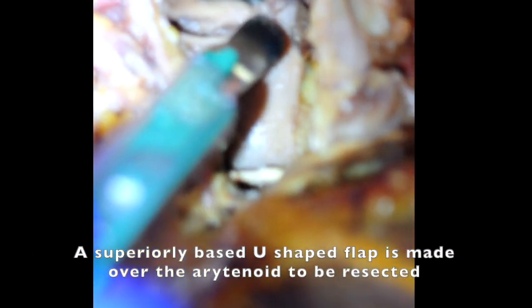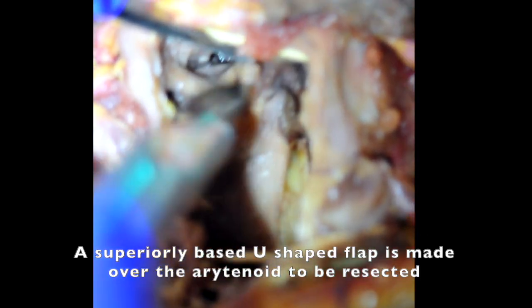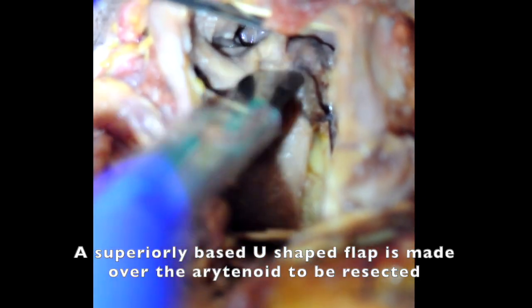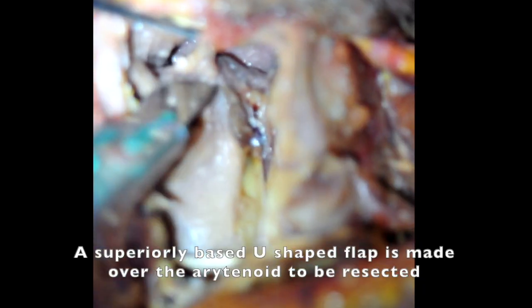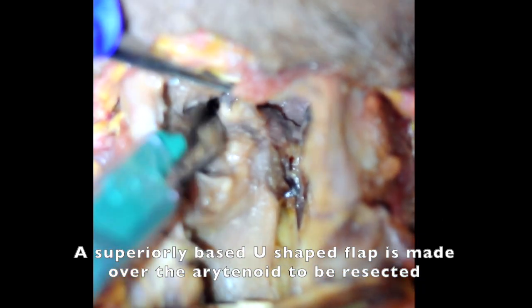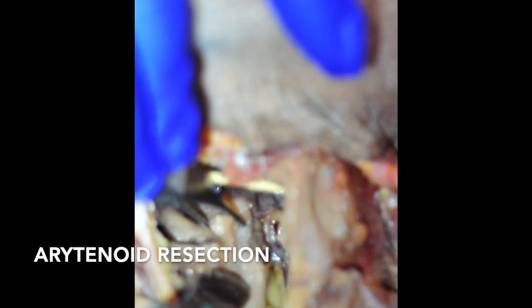Once the posterior cricoid split is completed, we will proceed to elevate the mucosa over the arytenoid for the arytenoidectomy. The arytenoidectomy removes only the cartilage and not the mucosa. A superiorly based U-shaped flap is used to dissect the mucosa from the cartilage. After the arytenoid cartilage is exposed, it is carefully removed.